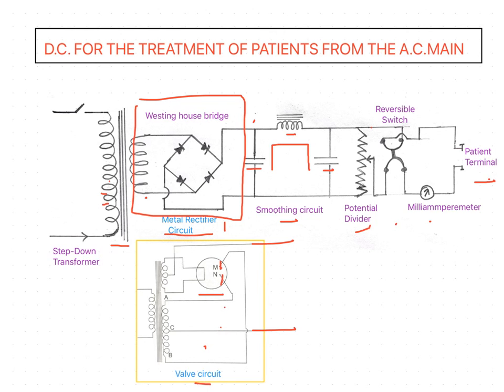Great care must be taken to leave the controls at zero, and it is advisable to detach the leads from the patient terminals while the apparatus is switched on but not in use, in order to eliminate the danger of electric shock from inadvertent contact with the electrodes. The physiotherapist cannot repair defects in the circuits of modern electrical equipment, but should be able to remedy faults in wall plug and lead connections.